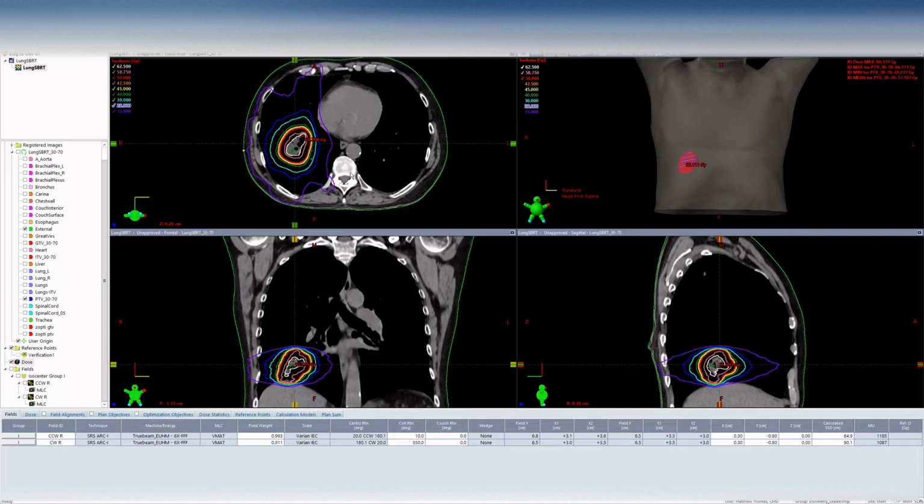And then there's this other one called the Paddick CI. The formula is a little different, so it takes into account location. It takes into account the volume of the 100% that's in the PTV, as opposed to just that's in the body. Okay, so this is just some context. And this is what we're going to be measuring, right?